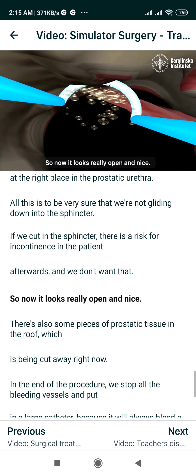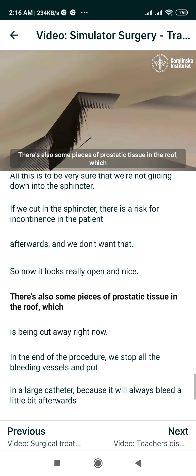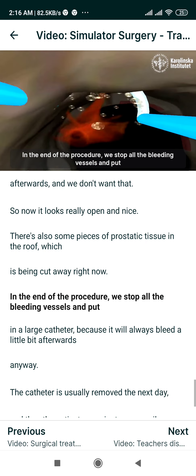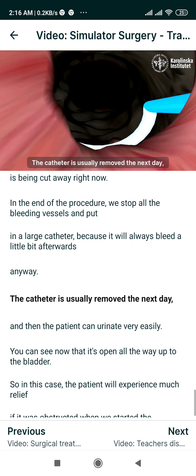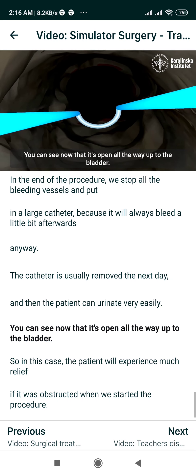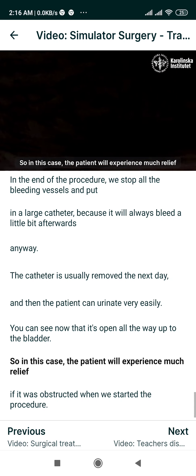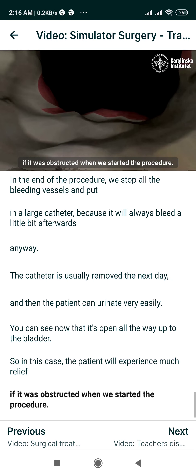So now it looks really open and nice. There are also some pieces of prostatic tissue in the roof which are being cut away right now. At the end of the procedure we stop all the bleeding vessels and put in a large catheter, because it will always bleed a little bit afterwards anyway. The catheter is usually removed the next day and then the patient can urinate very easily. You can see now that it's open all the way up to the bladder. The patient will experience much relief if there was obstruction when we started the procedure.